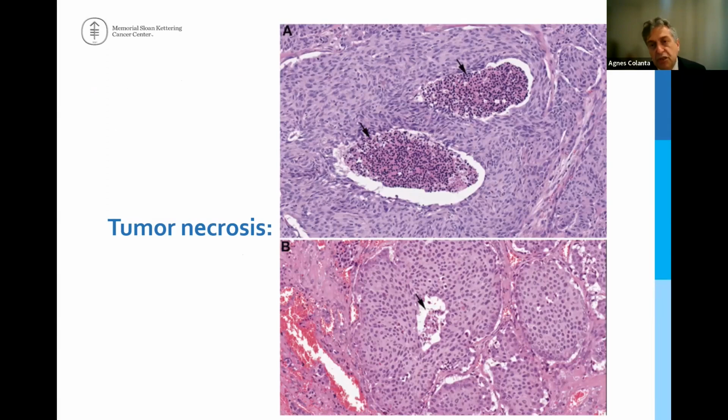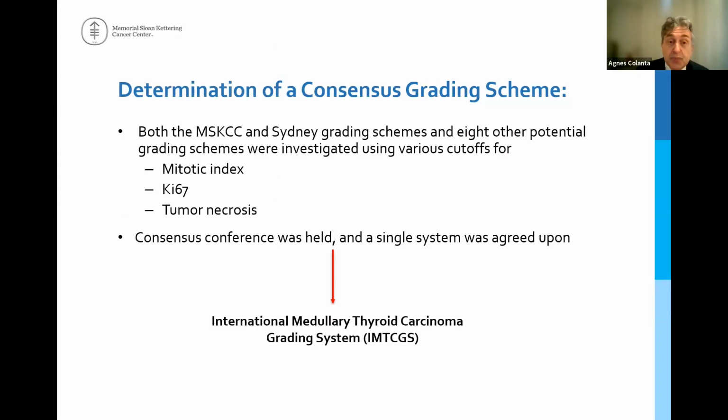This is an example of tumor necrosis. This should be differentiated from FNA-induced tumor necrosis. There is no fibrovascular proliferation. You have nuclear debris, abrupt necrosis, so to speak. And you notice here, interestingly, that there's not much nuclear pleomorphism in this area of necrosis.